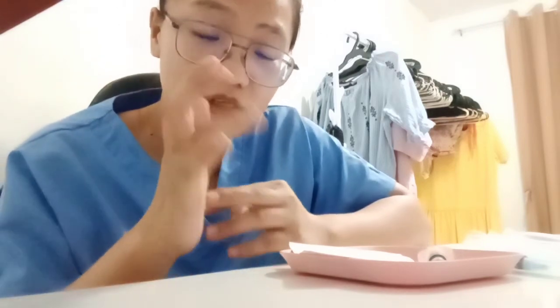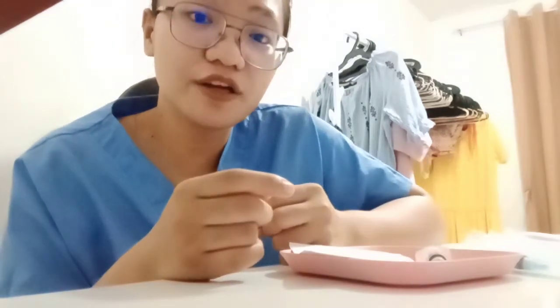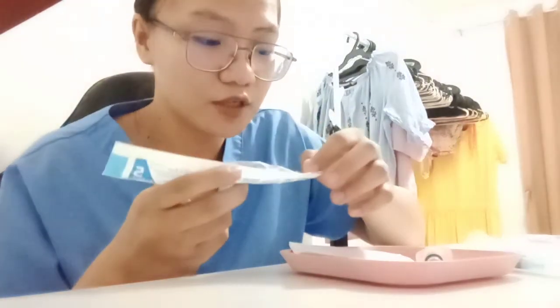I will be adding that if it is multi-dose, label it with the name of the vial and the date and time it was prepared, also the amount of the solution and your initials. And when administering injections, replace it with another syringe of the same gauge and length.